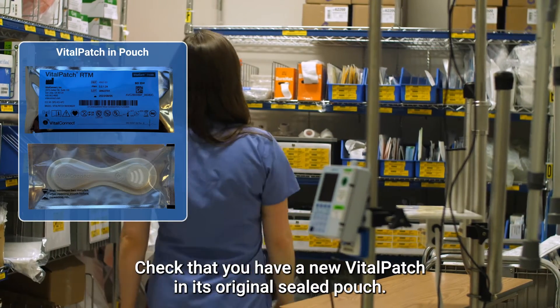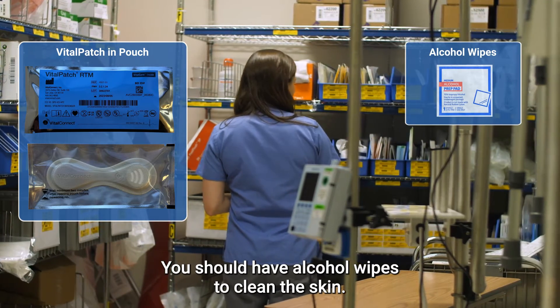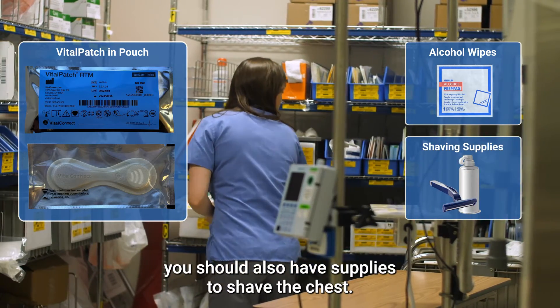Check that you have a new Vitalpatch in its original sealed pouch. You should have alcohol wipes to clean the skin. If the patient has hair on the upper left chest, you should also have supplies to shave the chest.